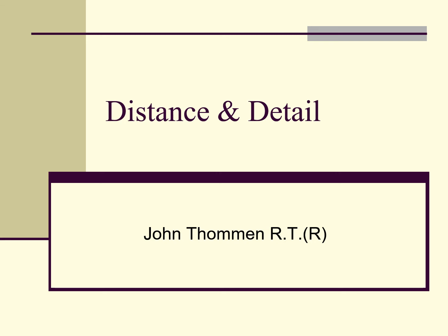In this presentation, I will examine the effects of source to image distance, SID, and object to image distance, OID, on detail. In practice, you will find that distance from the object being studied to the image receptor, object to image distance, forms the basis of many positioning decisions. For example, why is an AP spine preferred over a PA spine?